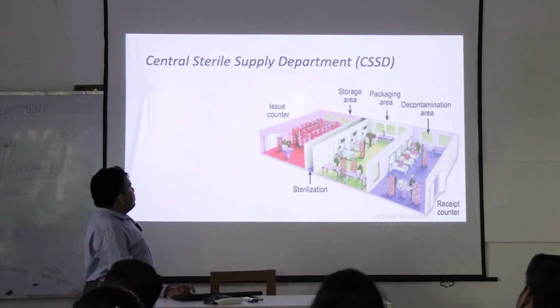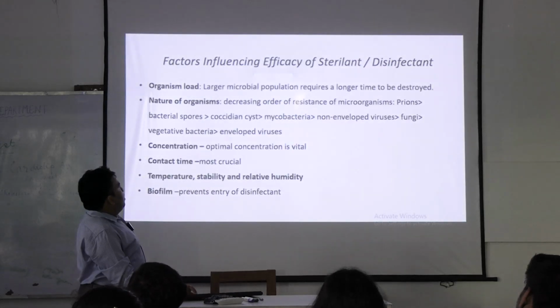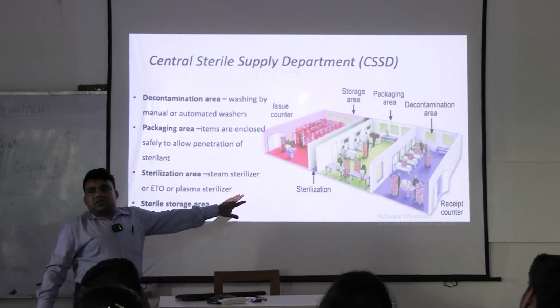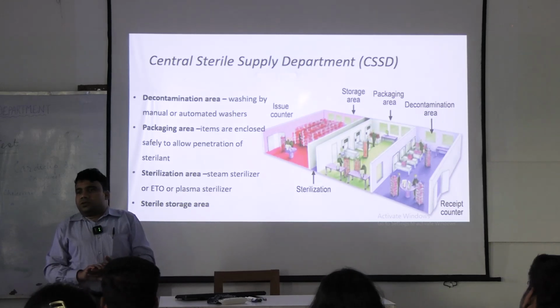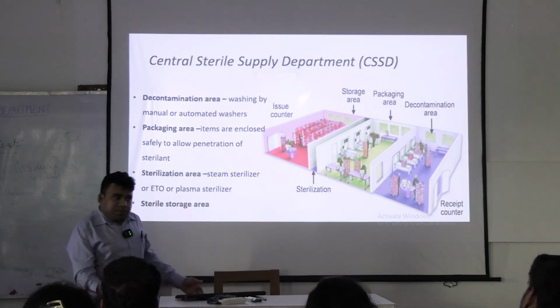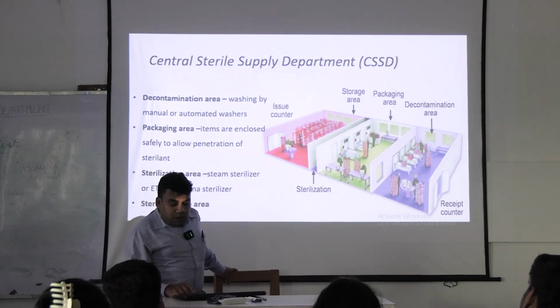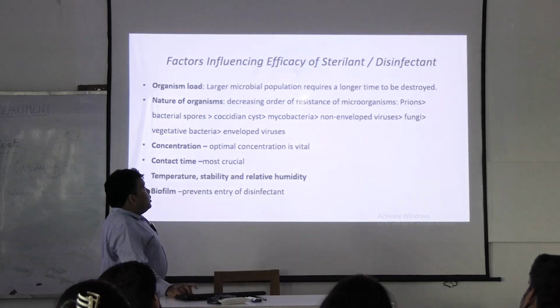So from this CSSD, every time any procedure has to be done on a patient, either in the ward or even in the surgical room, the instruments are issued from over here.